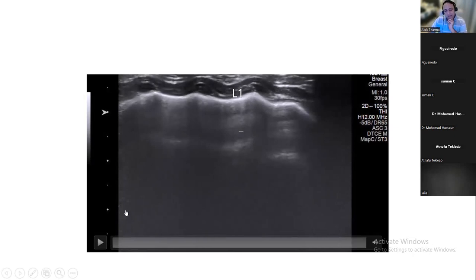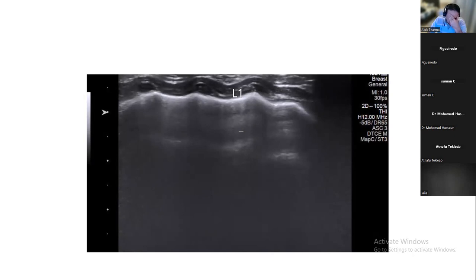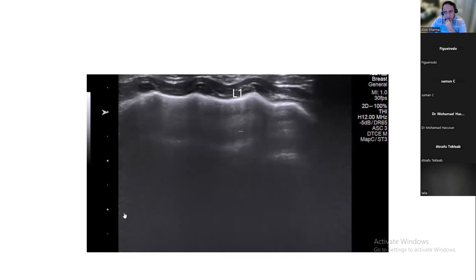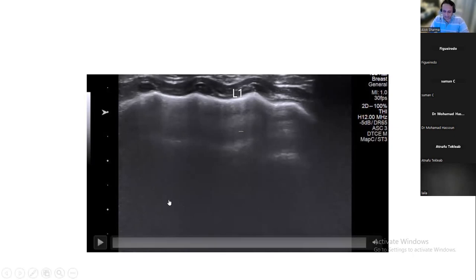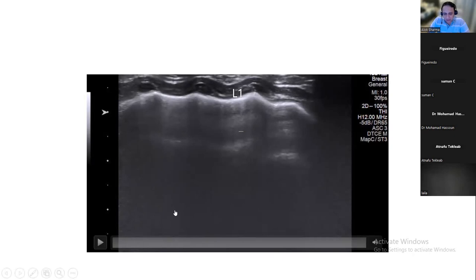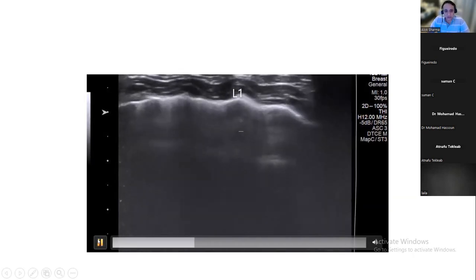The other thing is, again, just having a look: do you have total gain, time gain compensation on the probe? For this one, I have one machine. Totally. Again, just to try and see if you can increase the gain compensation in these areas, because I think you have decent gain settings in the superficial part. Definitely can be better. But the question is whether we might be able to increase gain settings in the lower half of the image. Just a little bit of playing with that. But yeah, well done. And a good diagnosis for you to pick up.